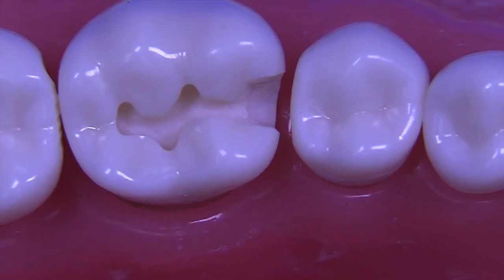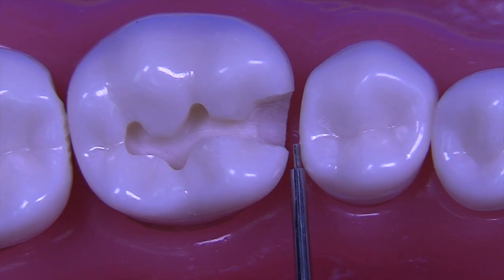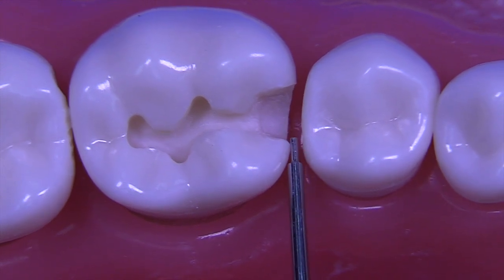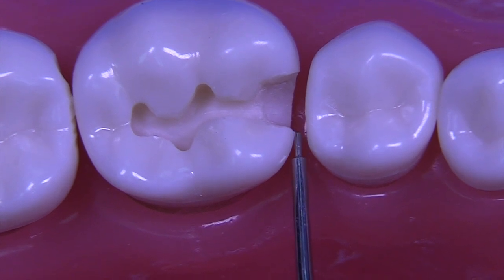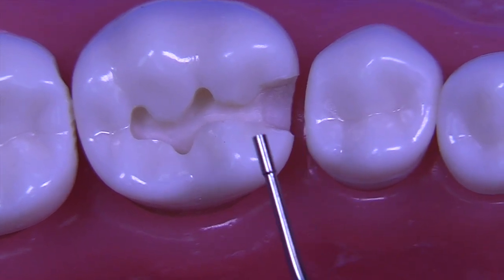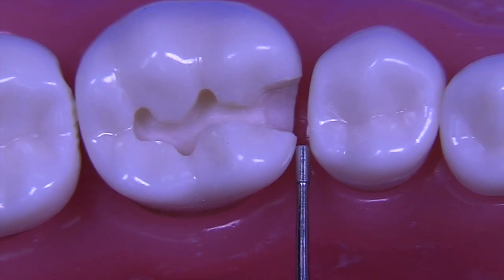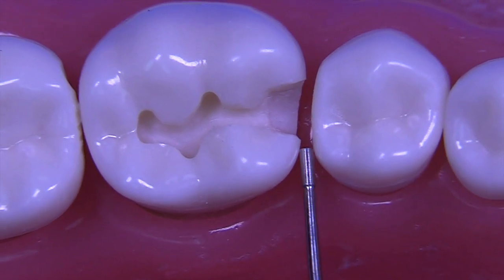Let's turn our attention to the interproximal outline form. You can see here that we have the RGS 1, which measures 0.4. And what we'd like to see is that the amount of clearance is about the same as the tip of this instrument. So you can say, oh, that's a little too much. How much is too much? Well, this is the RGS 2, and it measures 0.75. If this fits interproximally on the buccal and lingual, not the gingival, but the buccal and lingual, if this fits, we like to say that you've gone too far.